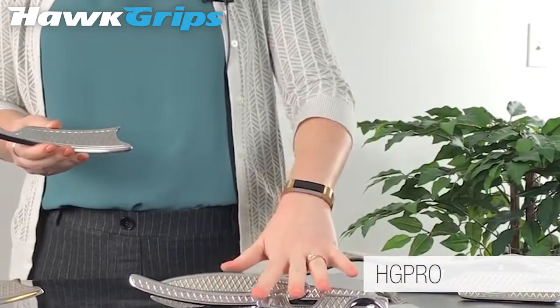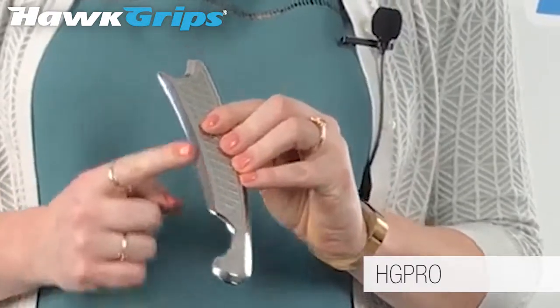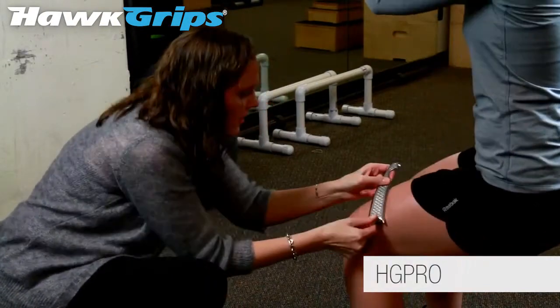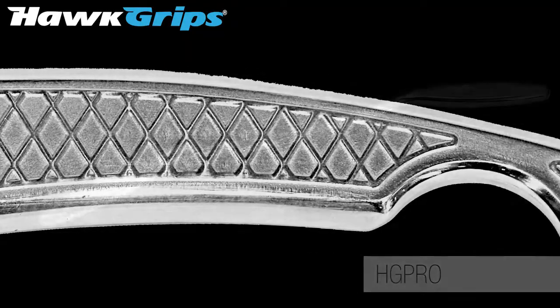We've taken these four instruments and combined them into a multi-instrument. Here we have a large concave surface, ideal for treating larger body areas with a gentler treatment surface. On the opposite side we have our large convex surface.